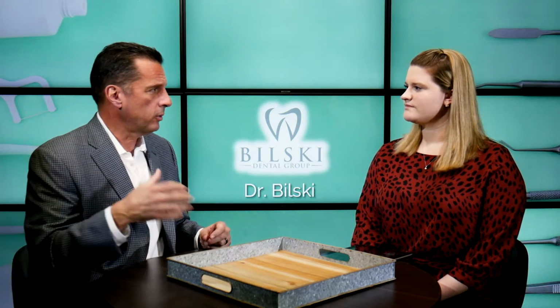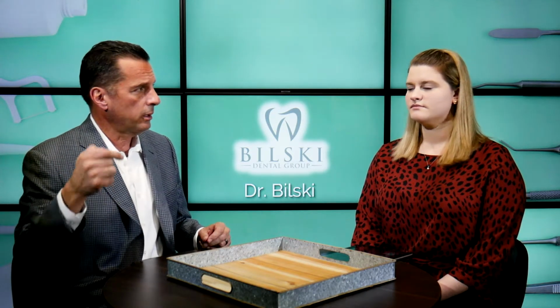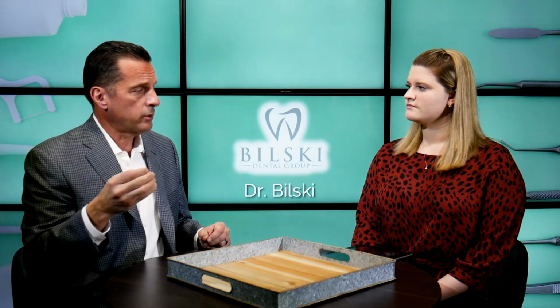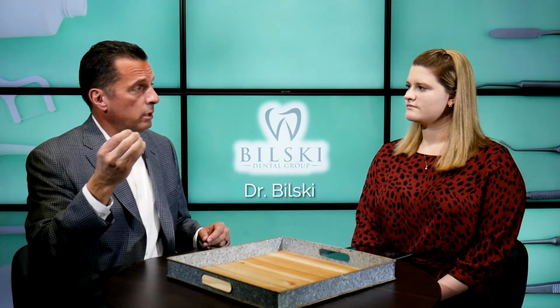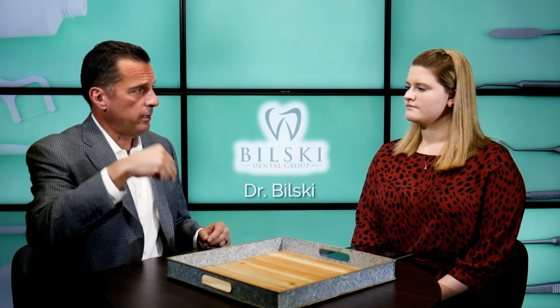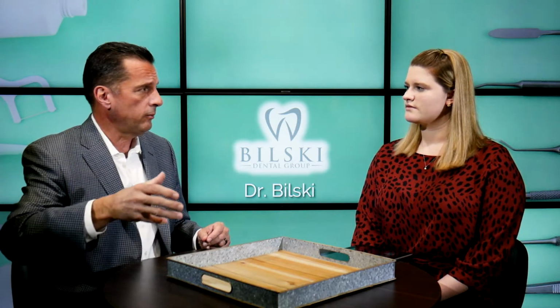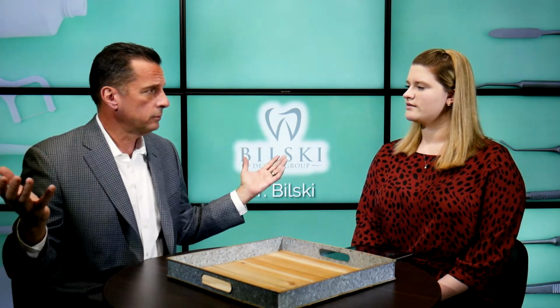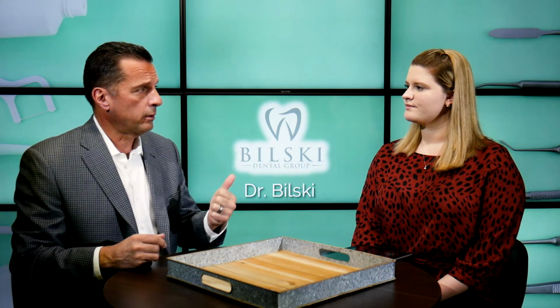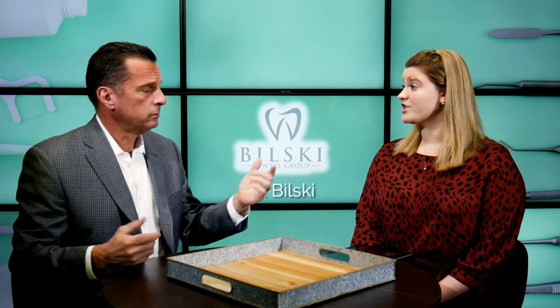with the bleach and the peroxide, then we dry it up, and then we take our CO2 laser and we place it inside the tooth. CO2 lasers are searching for water. Anything that's left inside that tooth, residual water, residual bleach, any peroxide cream, gone. So it gets it all out of there. And also removes viral and bacterial contaminants. Wow. So it prevents infection as well.